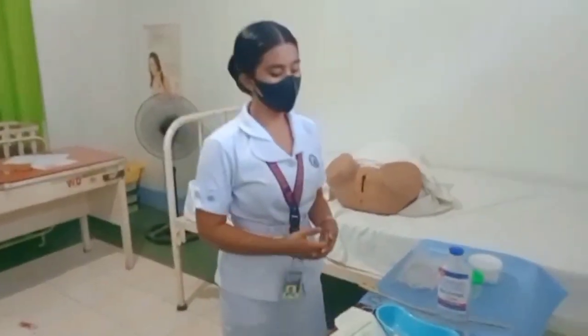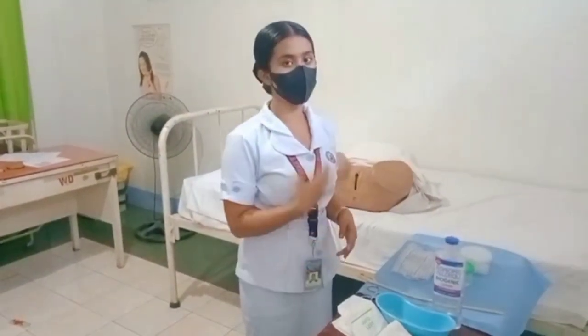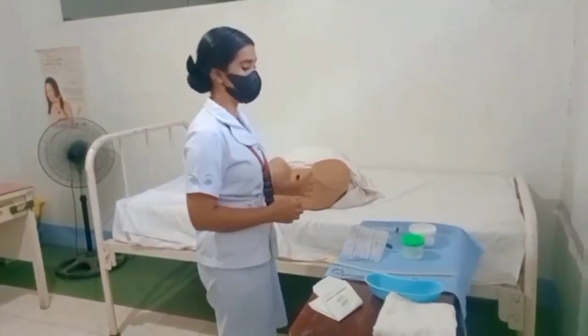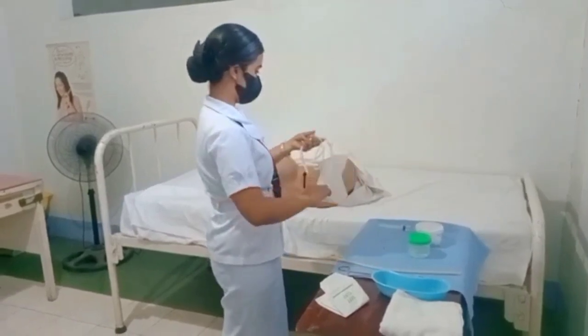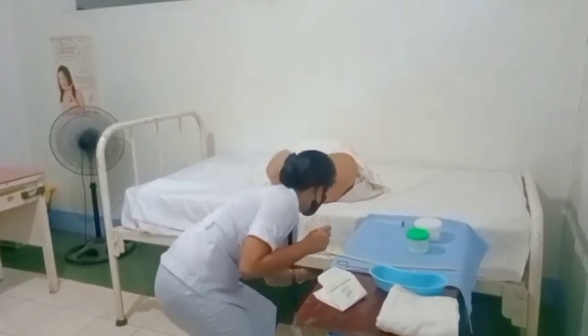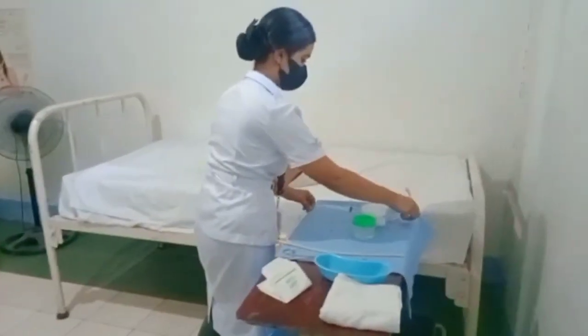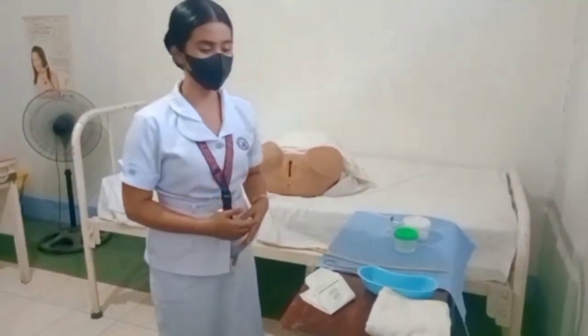And then I'm going to set up the receptacle for the soiled cleaning swab. Next, we will open the drainage bag and we will attach it to the bed. And then I'm going to wear the gloves.